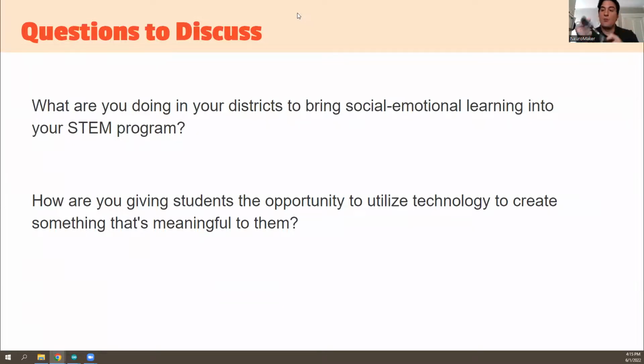What it does, and I could talk all day about this, and there's more curriculum to support it, is it measures the difference in voltage between different points, and we do a bunch of calculations to find out how strong that signal is, and then we map it over time and over frequency domain. I'm leaving a lot unexplained there, but essentially these are electric sensors. We take that electric activity and we run a bunch of algorithms over it to process out a bunch of stuff that we don't want and keep stuff that we do want, and then display it in those different forms that you saw on the screen just now. So I hope that answers your question. There's a whole lot more to unpack there, but that's, I think, the fastest kind of explanation I can do right now. Thank you, Andrew.